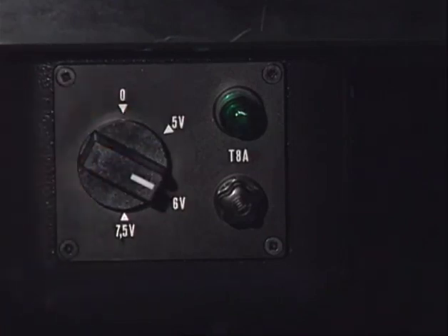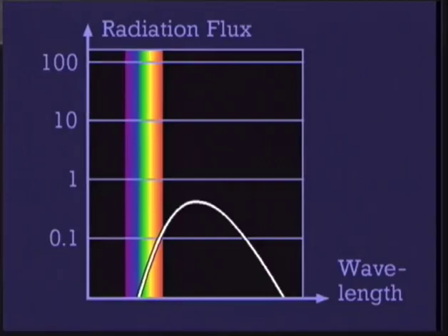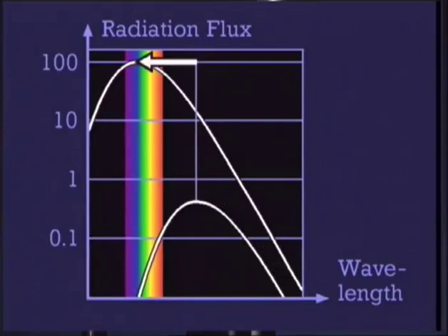But note, this diagram shows that hypervolting not only increases the brightness of the light, but also shifts the maximum brightness towards the short wavelength. The hypervolted light contains more blue rays.